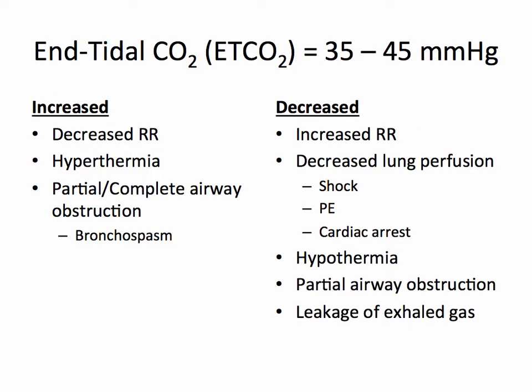End-tidal CO2 can be increased when there's a decreased respiratory rate, hyperthermia, or partial or complete airway obstruction. The end-tidal CO2 can be decreased when there's an increased respiratory rate, decreased lung perfusion, for example with shock, pulmonary embolism, or cardiac arrest, hypothermia, a partial airway obstruction, or leakage of exhaled gas.